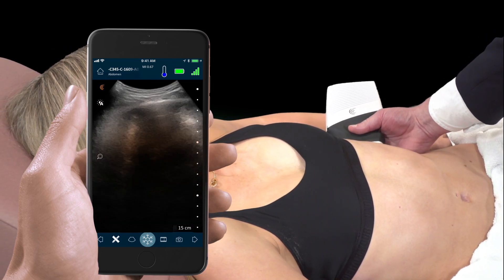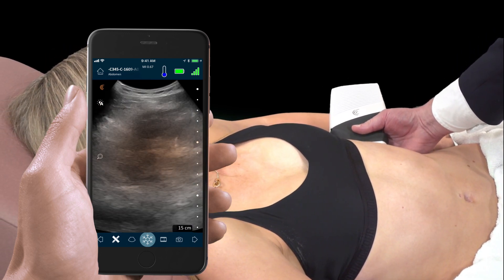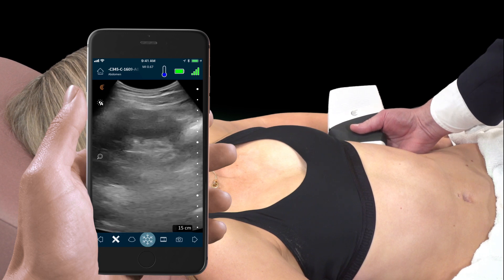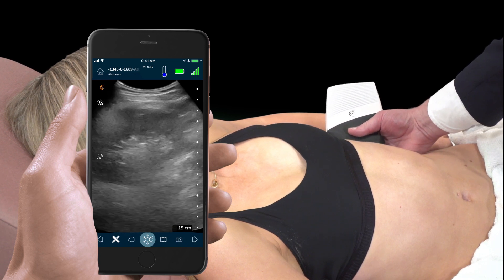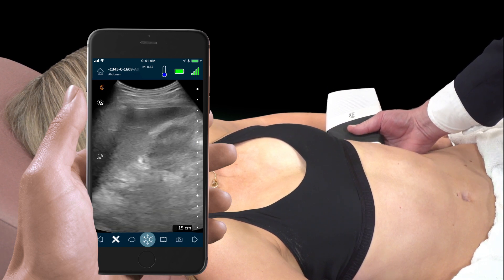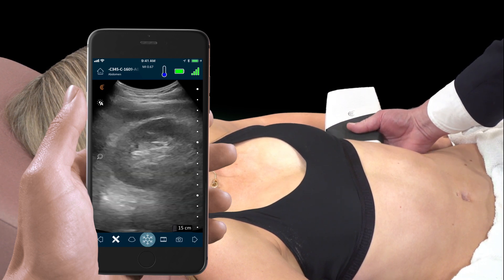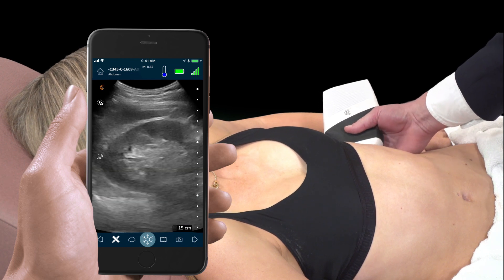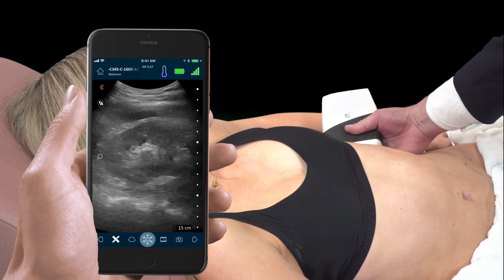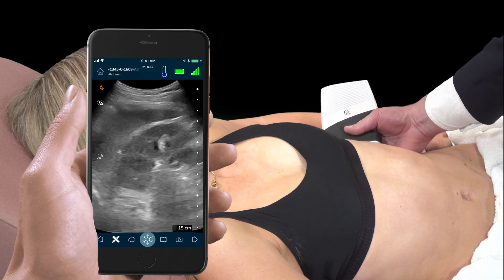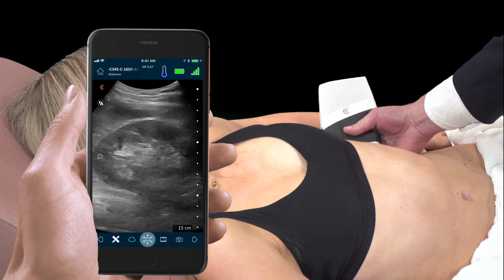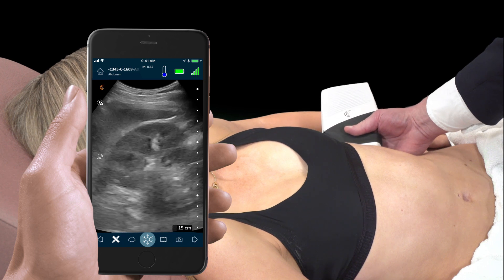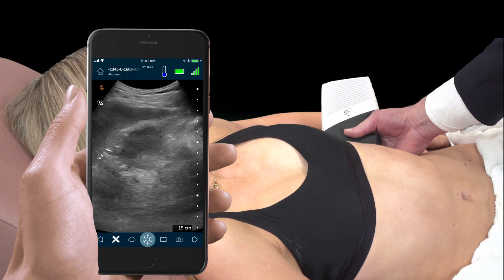The parenchyma should be darker — hypoechoic compared to the spleen. Again, we fan through the kidney, looking for any evidence of hydronephrosis.